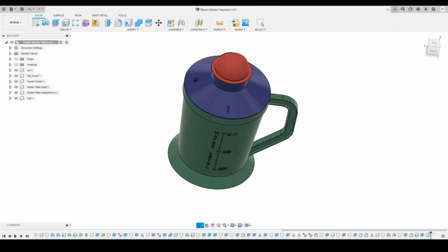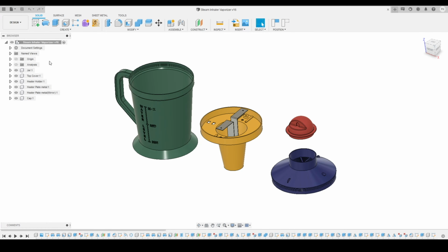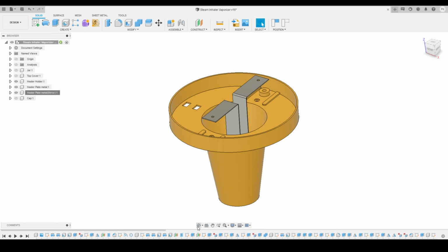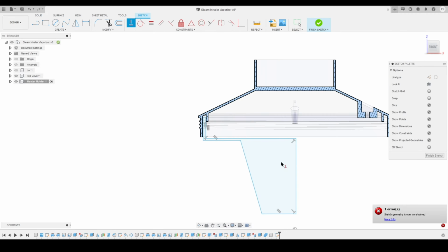This video is tutorial part 3 of Steam Inhaler Vaporizer 3D modeling inside Fusion 360. And in this video we are going to model heater plate and heater plate holder in Autodesk Fusion 360. We are going to use some reference measurements from top cover components.